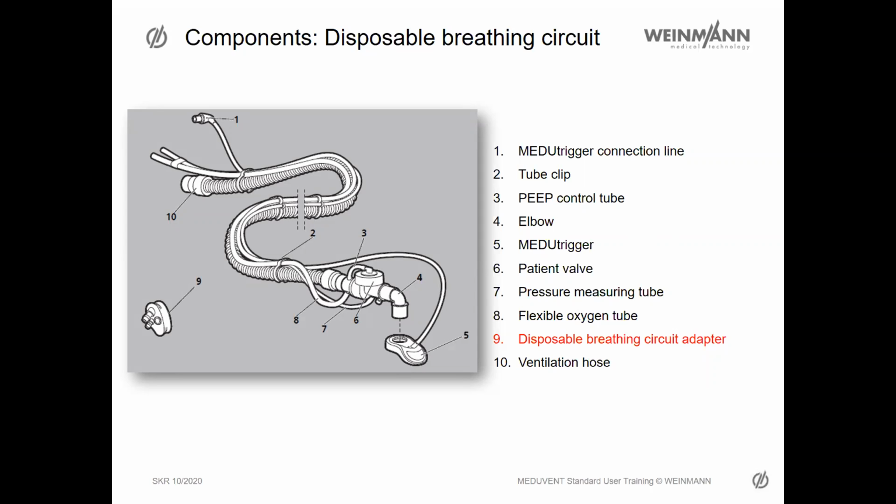The CO2 option is not an option of the MEDUVENT. As Samir said, we have some new options coming in time, so we have to see if this would be one option.